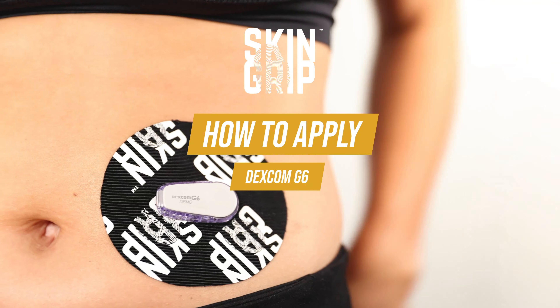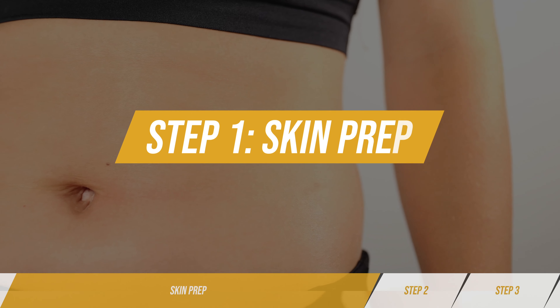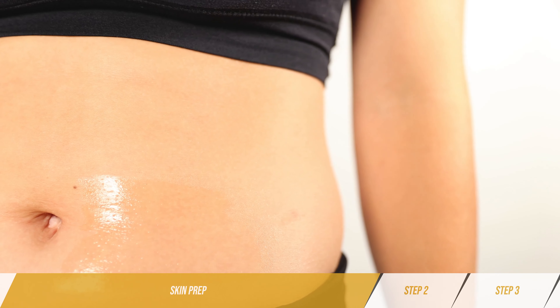How to apply your Dexcom G6 Skin Grip. Step 1: Skin Prep. Apply to clean, dry, hairless skin. For extra strength, wipe the skin with a skin tack wipe.